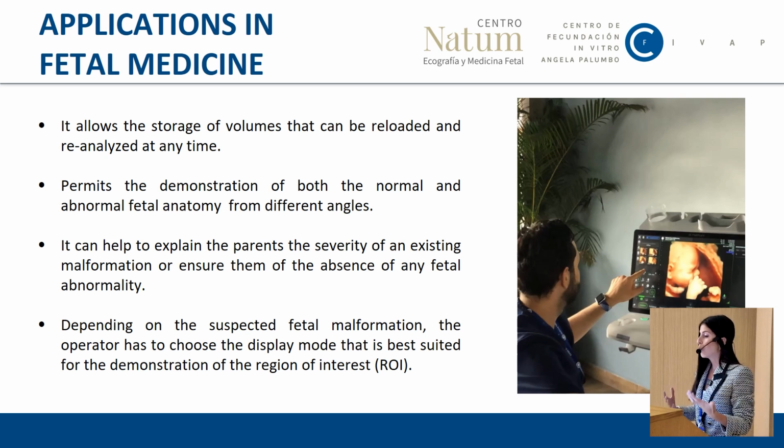When counseling patients, the rendered images can help them understand the severity of an existing malformation, or on the contrary, we can reassure them of the absence of any fetal abnormality. We can also show healthy babies. Depending on the suspected fetal malformation, we can choose the display mode best suited for the demonstration of the region of interest, which we call ROI.